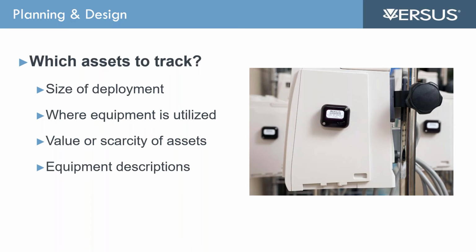And another thing to think about as well is if you do have 1,000 IV pumps and you're starting to add them to a system, a technology, and you want to differentiate between them, well, is this IV pump 1? Is this IV pump with equipment number 1, 2, 3, 4, 5 that we've taken from another equipment management system? How do we differentiate between equipment?